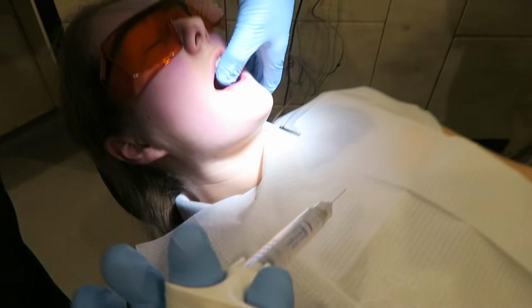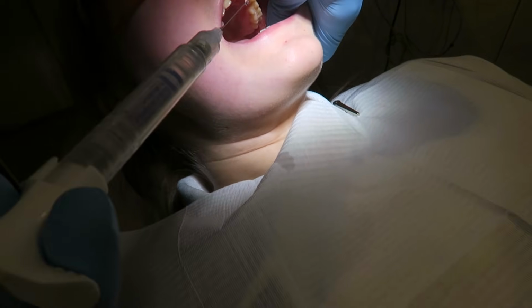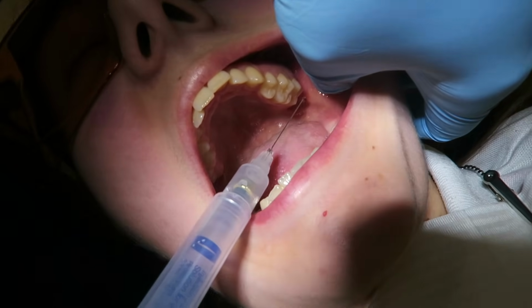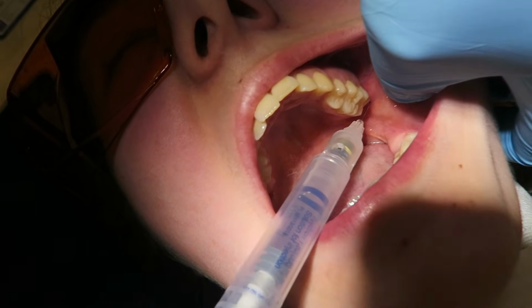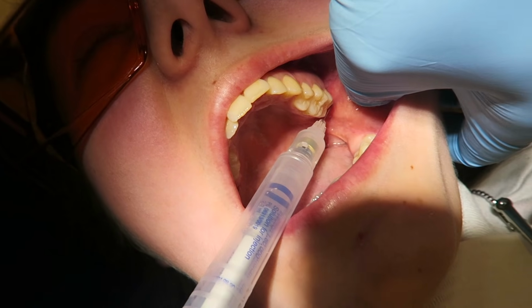So step 1 is achieving a good local anesthesia. So I use xylocaine to numb up the ID nerve. As you can see, I'm using my thumb to feel for landmark, which is the coronoid notch in this case, and I approach the anatomical side from the opposite side between 4 and 5 and about 1 centimeter above the occlusal plane, hitting the point that is bisecting my thumb fingernail.